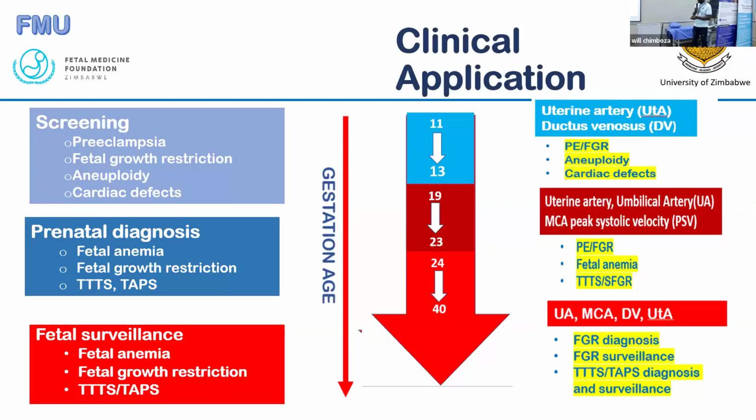TTTS and TAPS, it's also taking advantage of the ductus venosus and the umbilical Doppler to actually diagnose this condition. I think it will also be discussed in greater detail during the multiple pregnancy session.